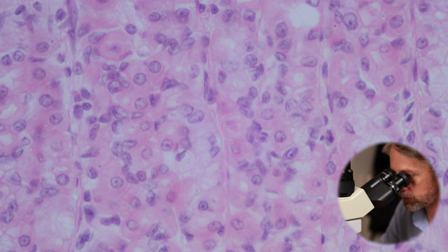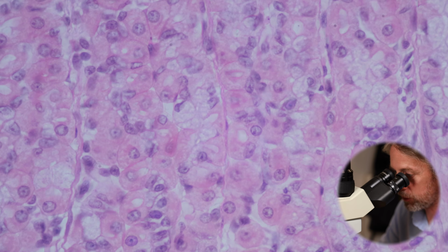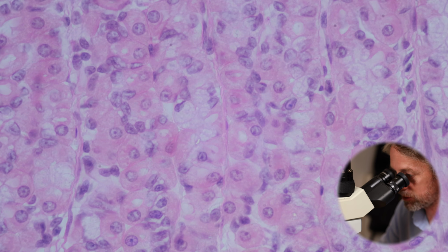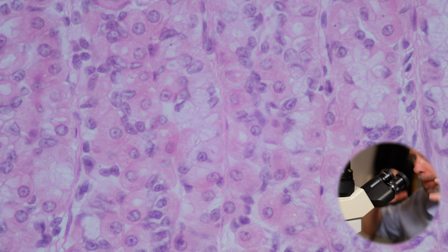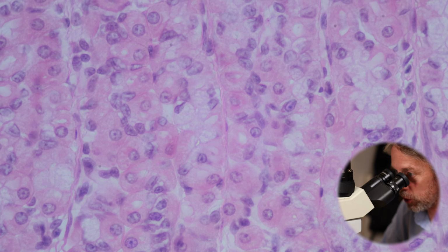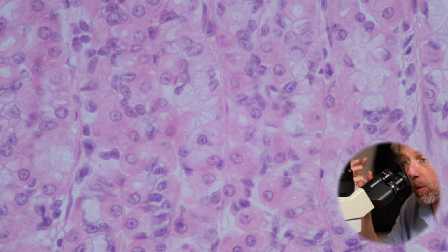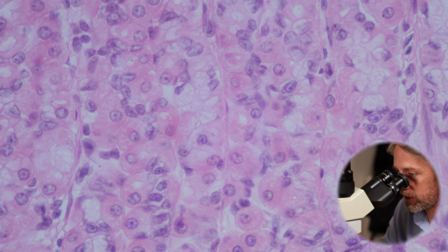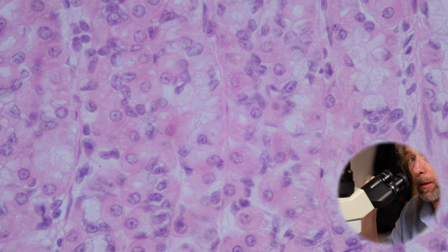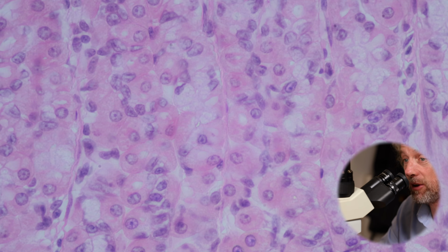But then as we get down into this layer here, these cells are all the cells of the gastric glands. And they do have some shape, they do have some structure, they're surrounding tubes which are connecting with these gastric pits. But there are 4 types of cells down here that we're interested in. We have parietal cells, we have chief cells, and then we have neuroendocrine cells, and we have stem cells.